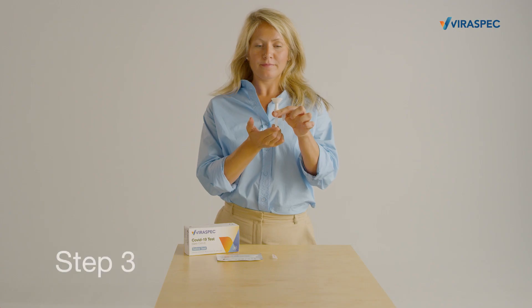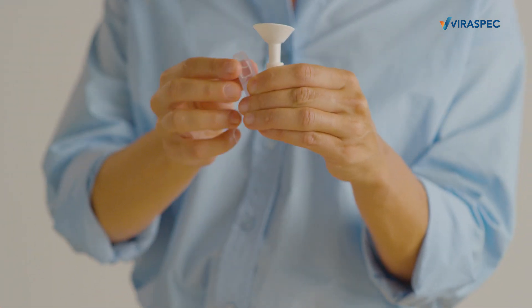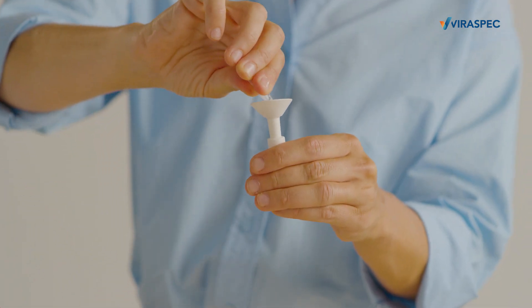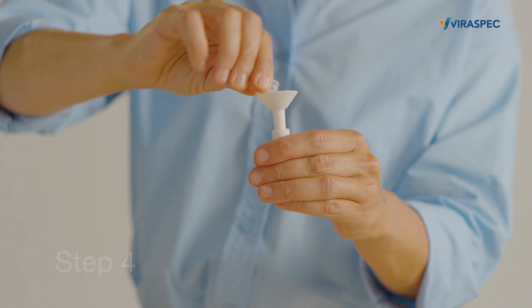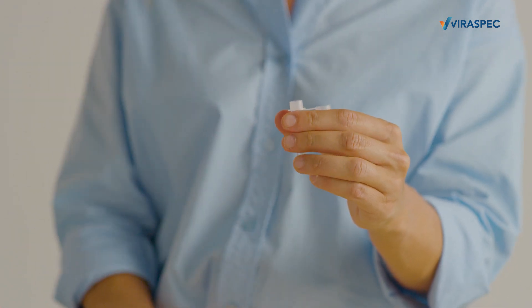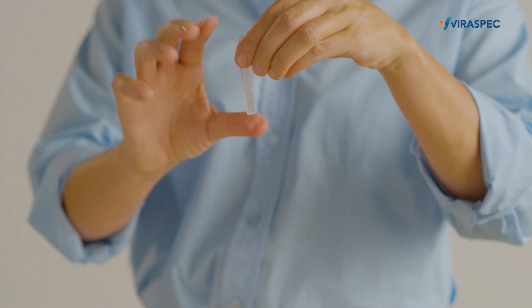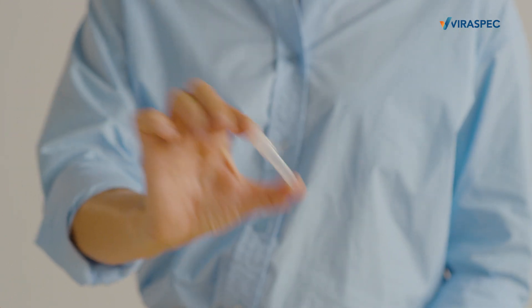Step 3: Open the extraction buffer tube and empty the entire content into the saliva collection tube. Step 4: Remove the saliva collector, put the top firmly on the collection tube, and then shake it well to ensure that the saliva and the extraction buffer mix completely.